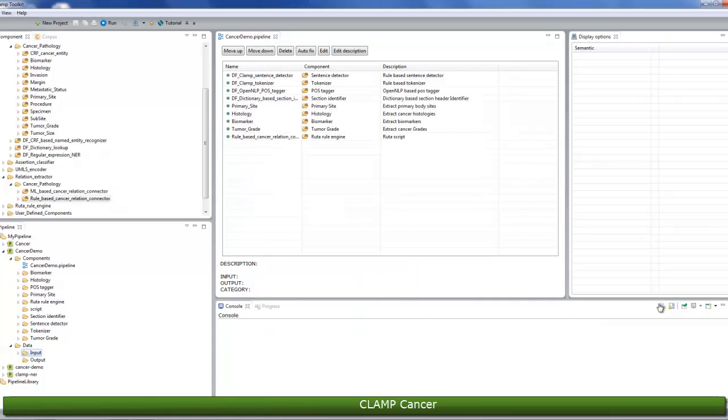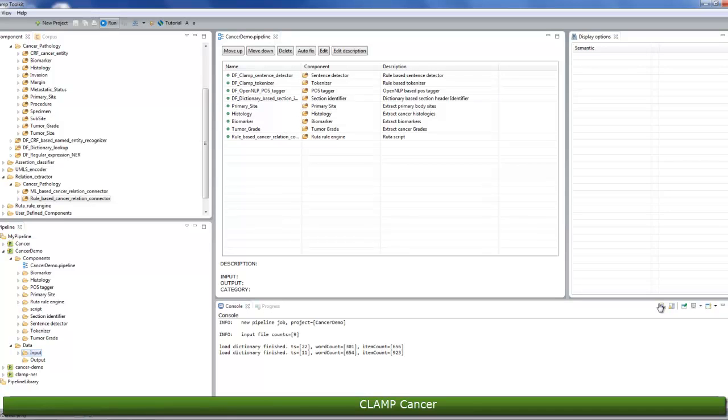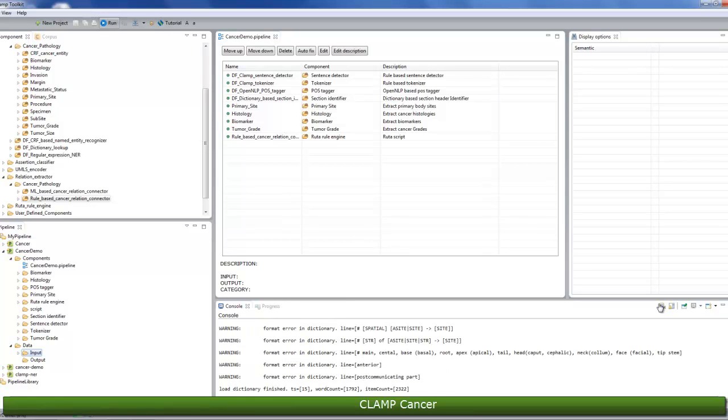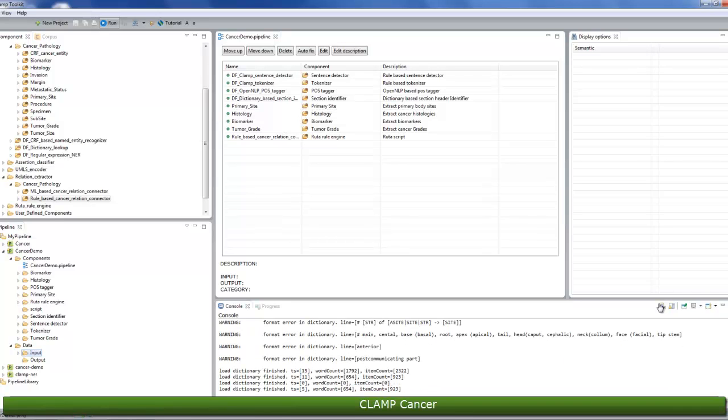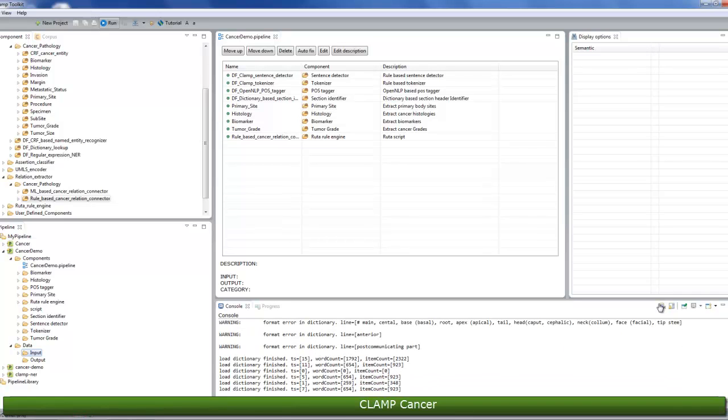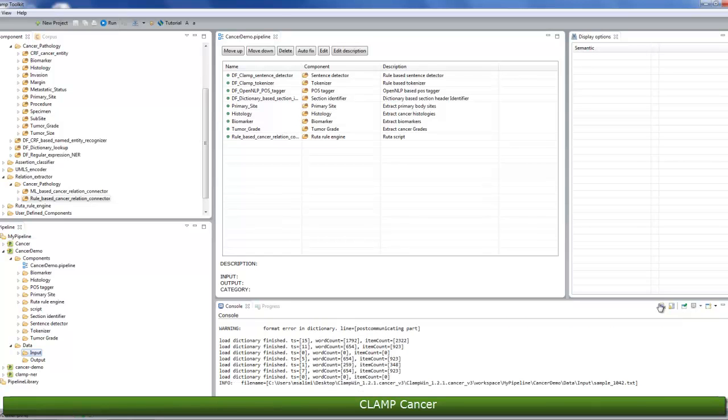Now that you're done configuring the pipeline and importing your materials, it's time to start running the pipeline. To run a pipeline, simply click on the Run icon at the top of the screen. Once the pipeline starts running, you can check the progress of the process from the console window and the progress bar at the bottom of the screen.